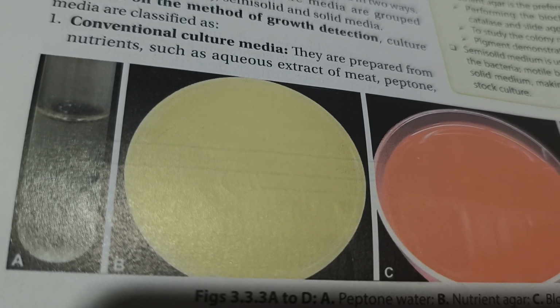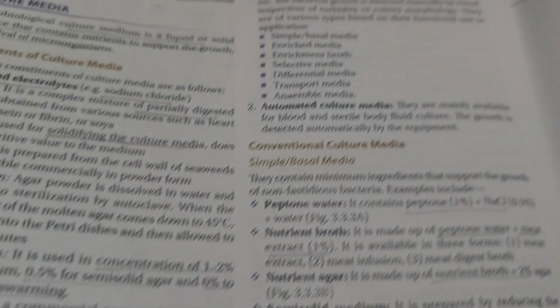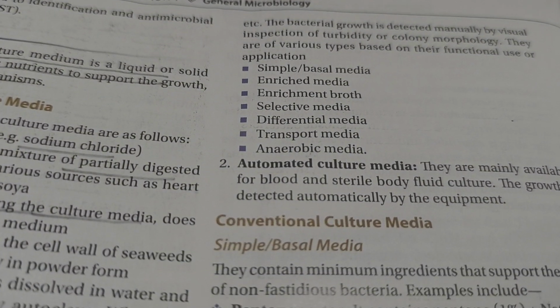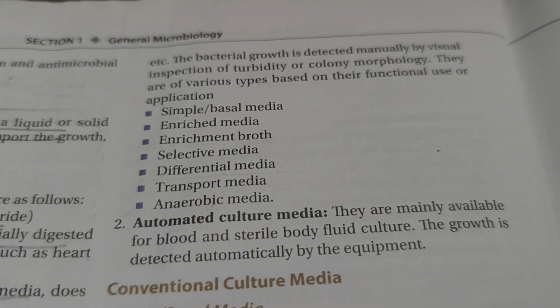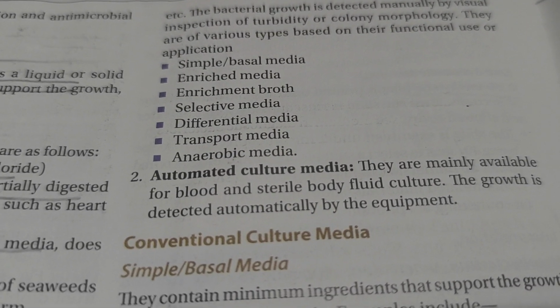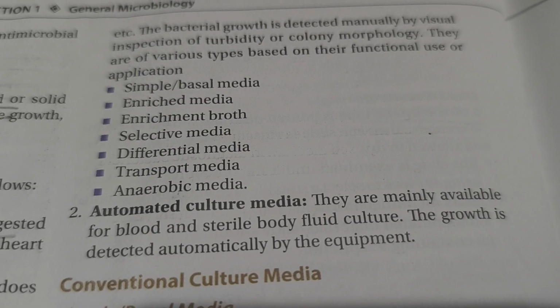They are prepared from nutrients such as aqueous extract of meat, peptone, etc. Bacterial growth is detected manually by visual inspection of turbidity or colony morphology.